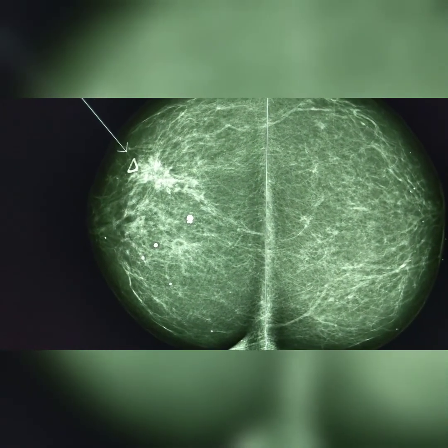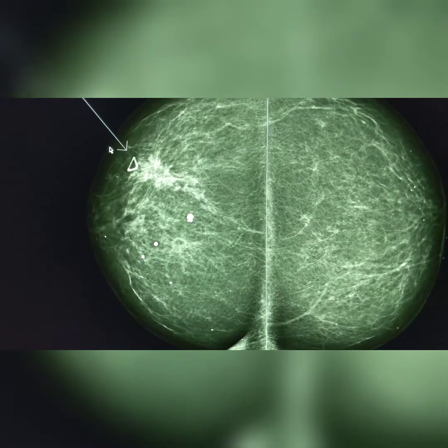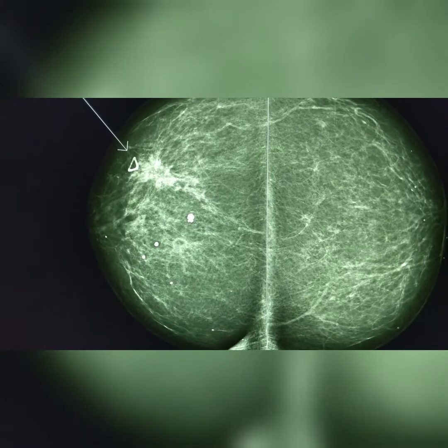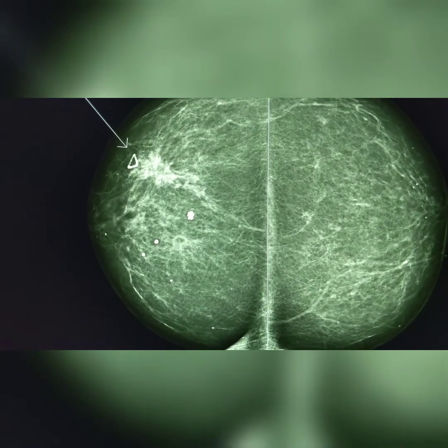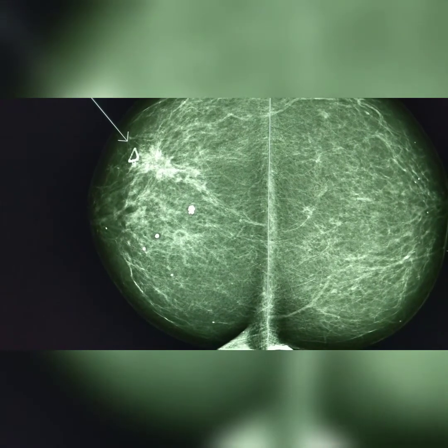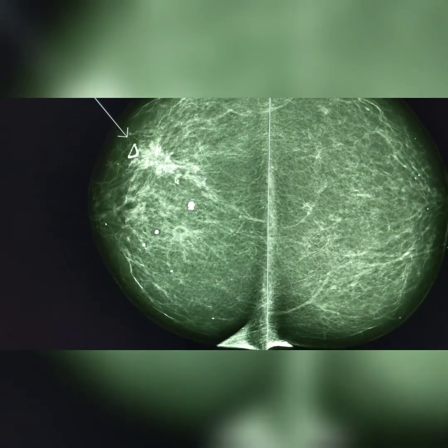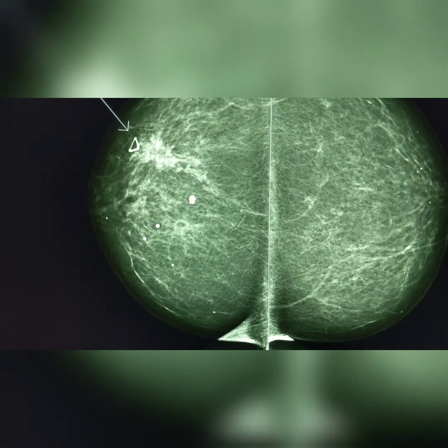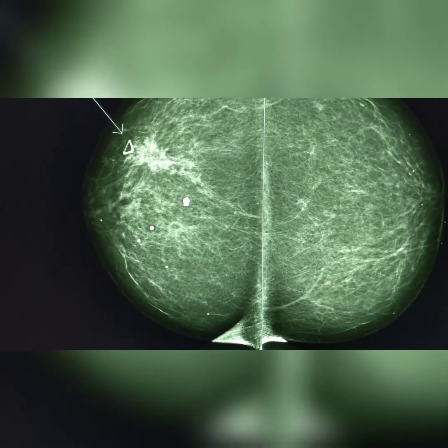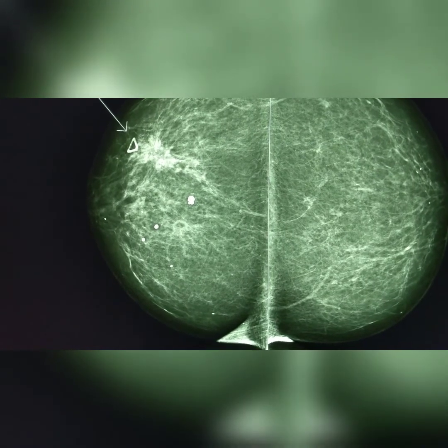I mean, this is a fairly obvious one, and you also have the arrow sign, as we call it in radiology, pointing at this thing here, which looks like a pretty scary looking mass. It's got spiky edges to it. We call it spiculated margins. It looks kind of like a star in a way. So that is definitely something that stands out on this.